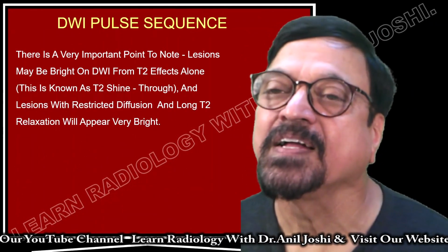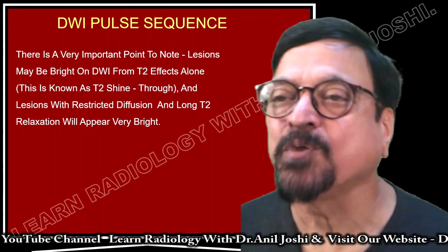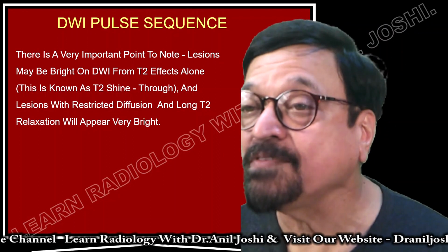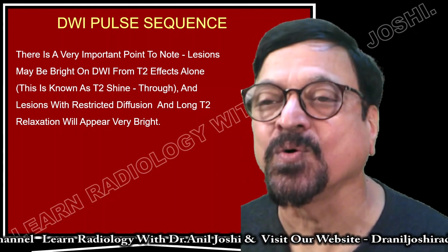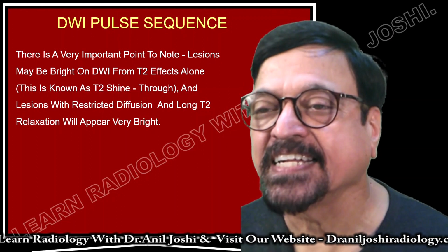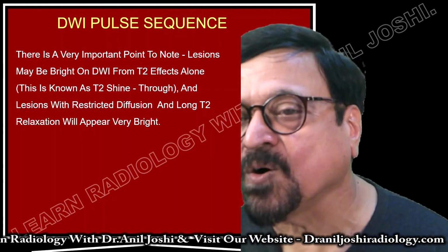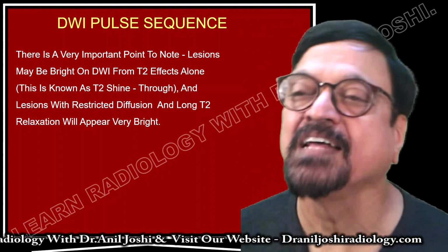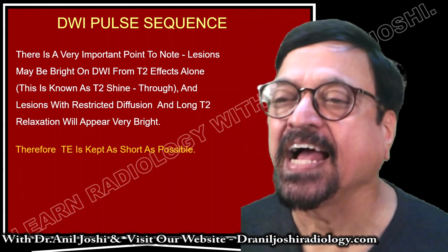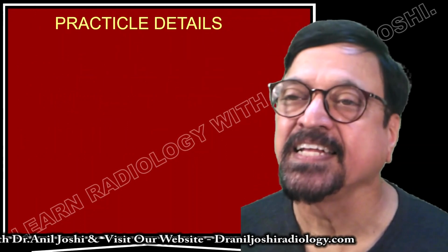Now, there is a very important point to note. Lesions may be bright on DWI from T2 effect alone. This is known as T2 shine through, and lesions with restricted diffusion and longer T2 relaxation will appear very bright. Therefore, TE is kept as short as possible in these sequences.